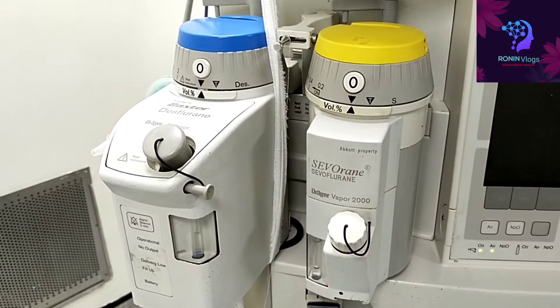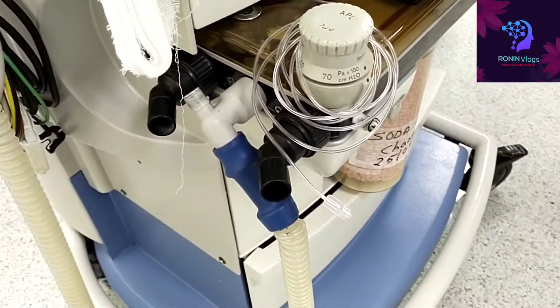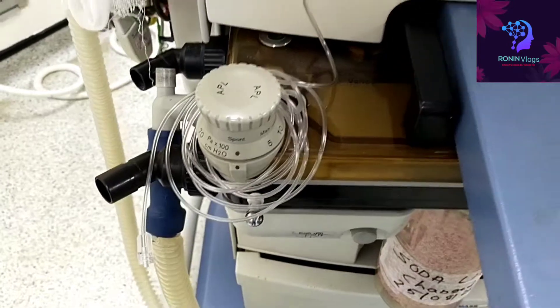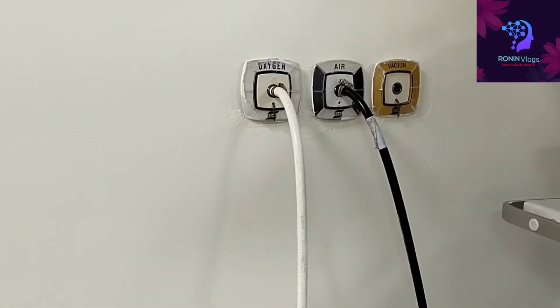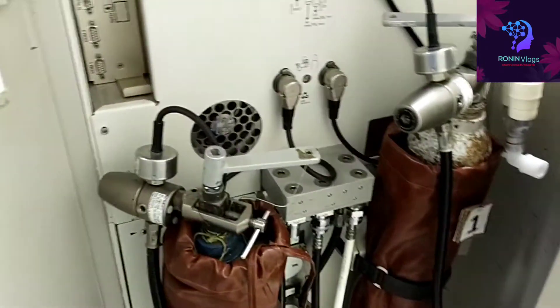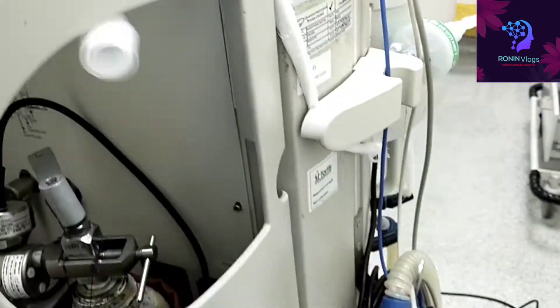These are the anesthetic gases — sevoflurane and desflurane are the two gases we are mainly using. We are free from nitrous oxide, so we do not use nitrous oxide. This is the inlet and outlet; the flow sensor is inbuilt. This is the soda lime on the down side, and this is the main air and oxygen supply. This is the standby oxygen and air cylinder, but we are not using it because central supply is available — it is kept as standby for emergency purposes.